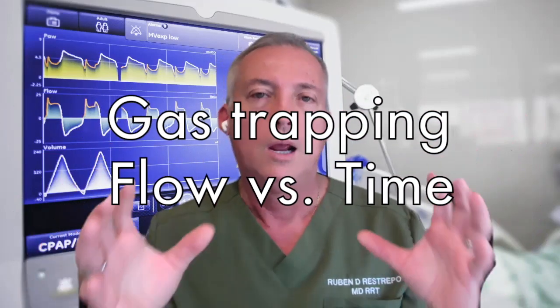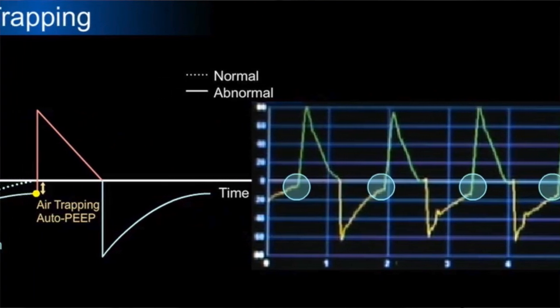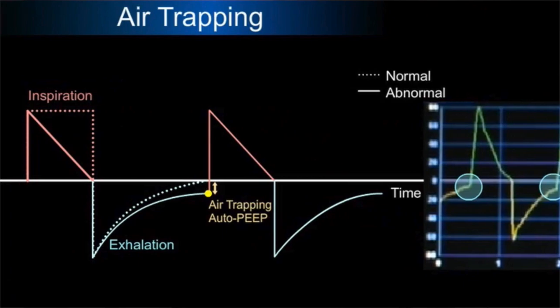It takes a while for clinicians to switch to loops. But in front of the scalars, what you want to look at is flow. And in the particular case of flow, what you want to look for is the inability of the expiratory flow tracing to go back to baseline, and it creates a gap before the next breath occurs. That is the presence of gas trapping.